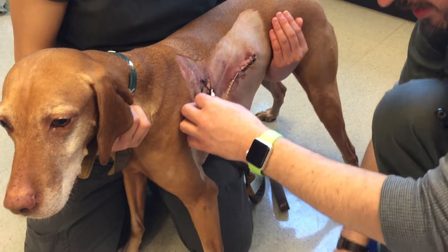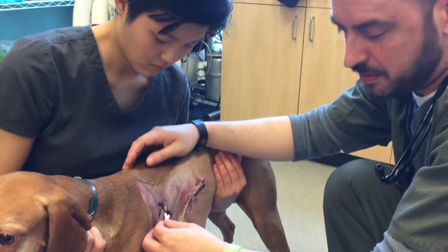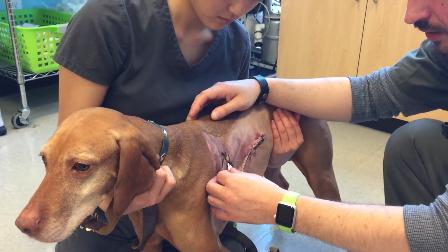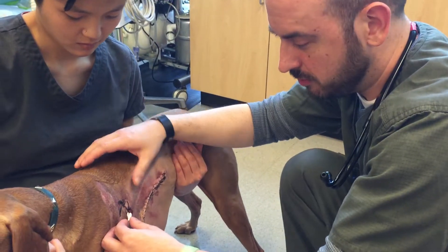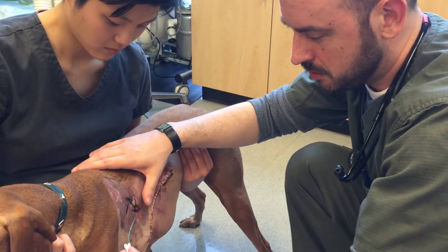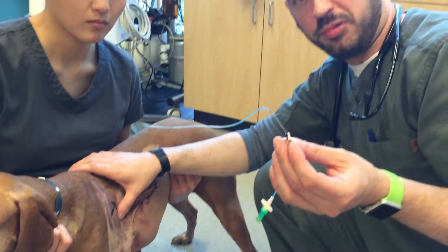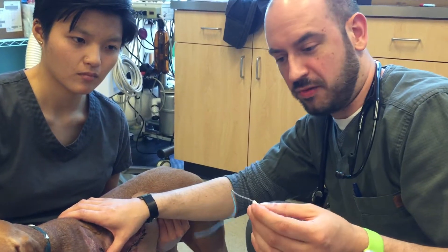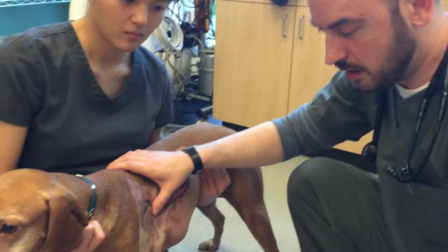We're just going to check to make sure the catheter is mobile. She doesn't seem to be responding, so in one quick, smooth movement we're going to pull straight out to remove the catheter. As you can see, it's pretty long and it just kind of coils up right underneath the skin, so that we can infuse that bupivacaine right into the operative site.